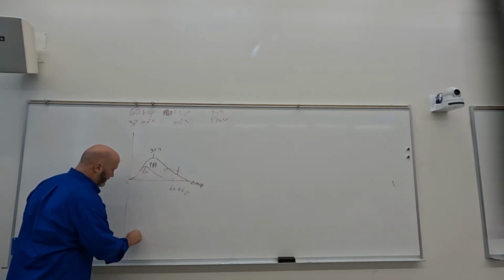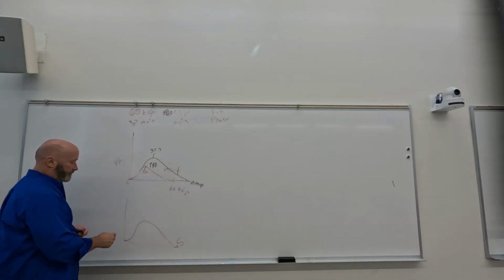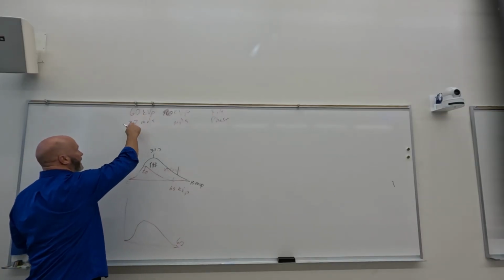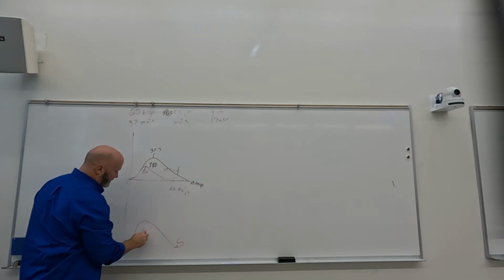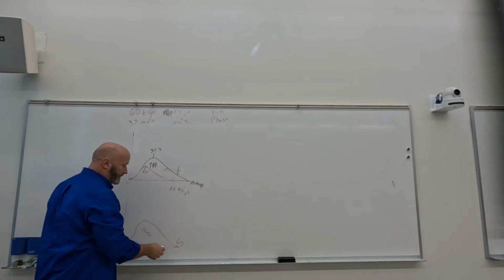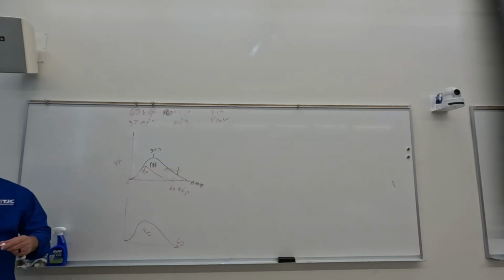With mAs, I'm not going to draw the raw spectrum, but you've got here, and our peak energy is 60 kVp. When you increase your mAs, we go from 32 mAs in this case. Let's say we're going to go to 100 mAs. So what's going to happen to our peak energy as we increase mAs? You're adding more, so it's still going to go up.